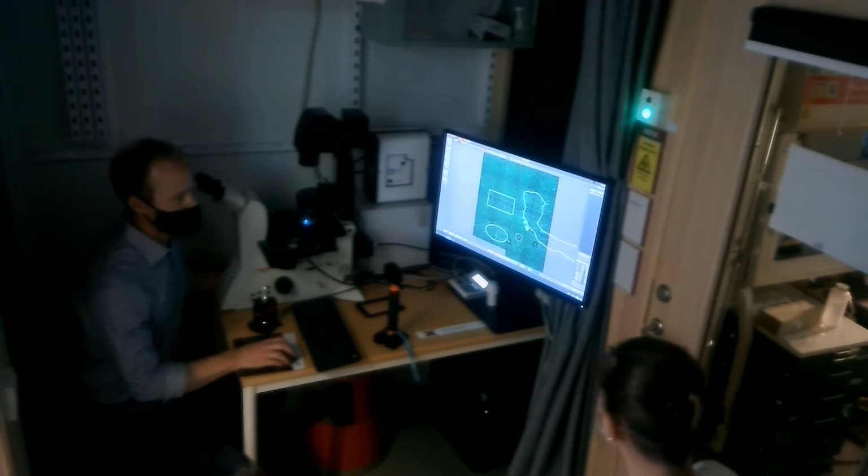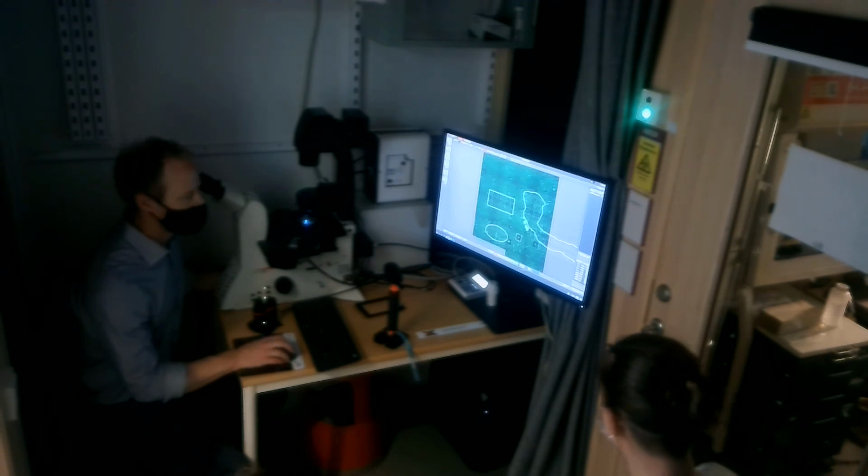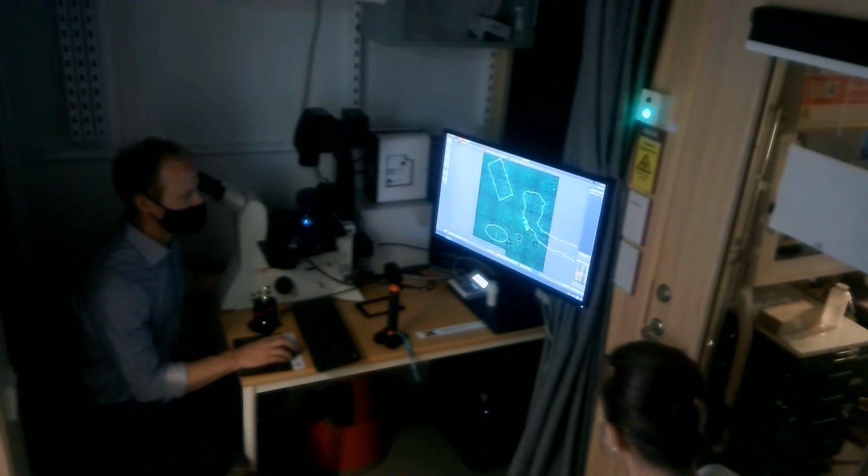Either way, in this task list, if you've drawn something that you don't want, you can always remove it here. Just delete this region. You can also, with the select tool, select one. You can move it around. You can also angle it if you want. You can also resize it. And you can also delete it if you have that selected. Okay?